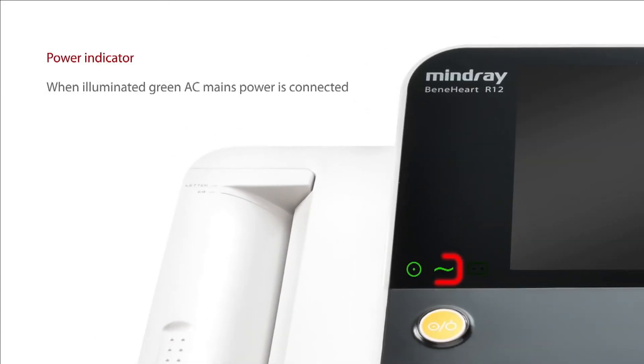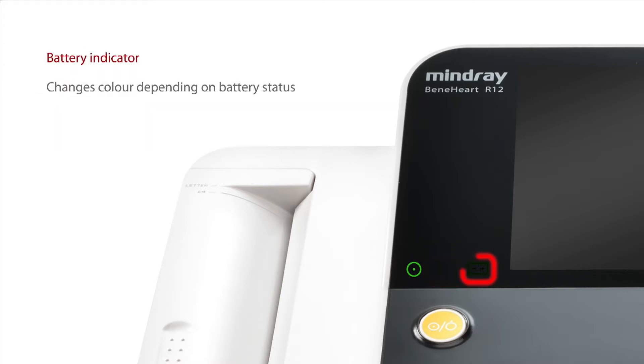This is the power indicator. When illuminated green, AC mains power is connected. This is the battery indicator, which will change color according to battery status.